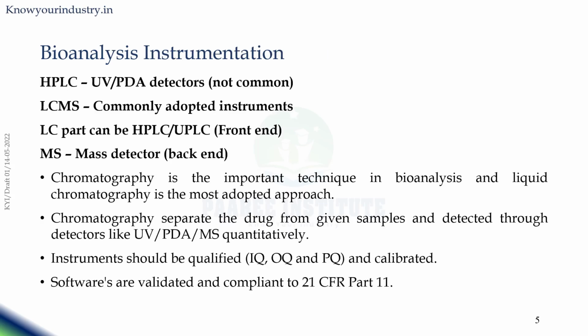Now we are going to talk about the instrumentation adopted for bioanalysis. In the older days, HPLCs were the most commonly used instrument in bioanalysis.